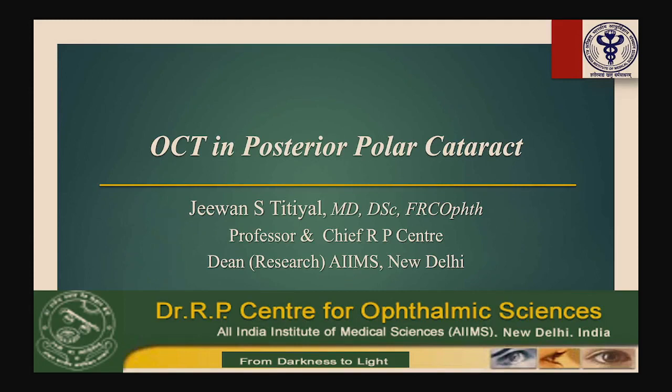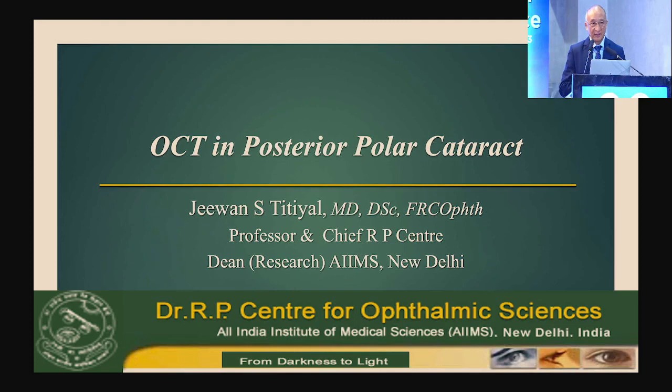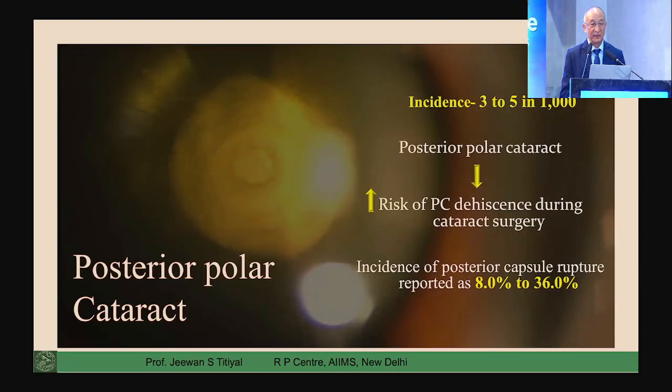Indeed, we had a terrific talk just before me. Dr. Mahipal and Dr. Sirignes talked about innovations. That innovative lens can only be put in if you do a good surgery, in a difficult situation also. And one of those is a posterior polar cataract, where things can be very difficult.